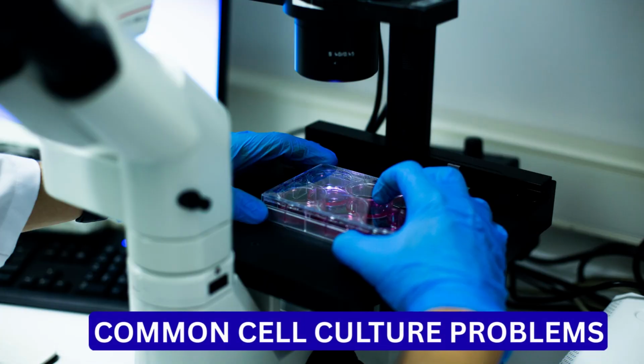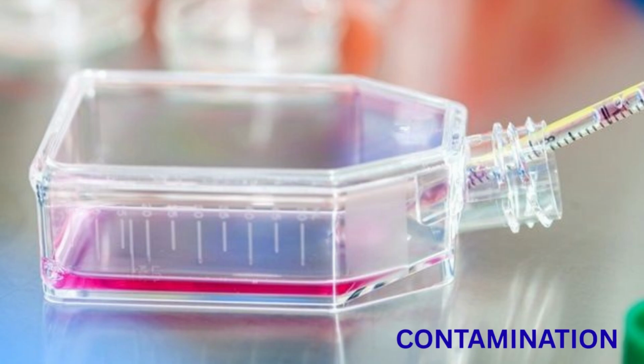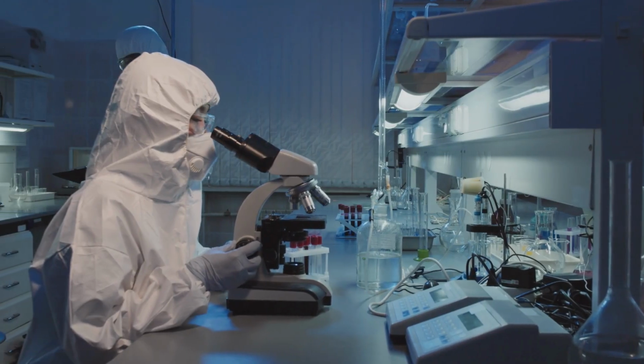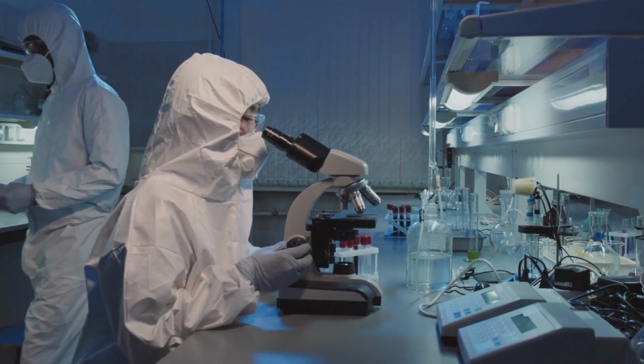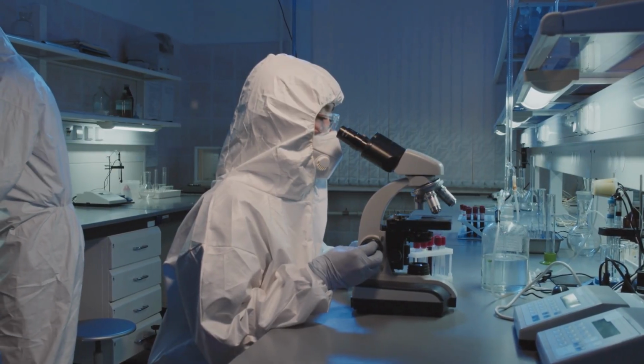Even with good technique, problems can still occur. The most common issues include contamination, poor cell growth, and unexpected cell death. Regularly observing cells under the microscope helps detect these problems early. Maintaining good laboratory habits and responding quickly to changes in cell behavior can prevent small issues from becoming major setbacks.